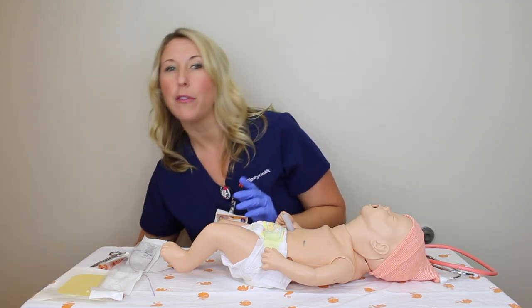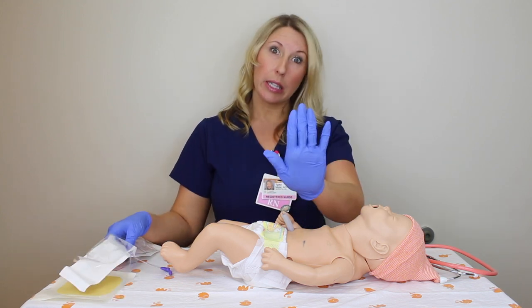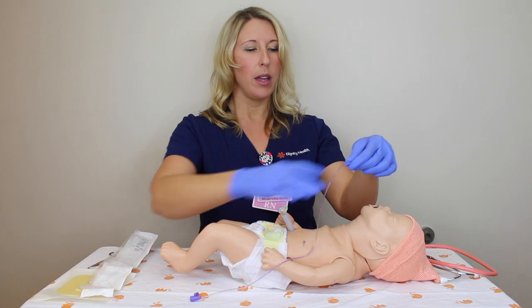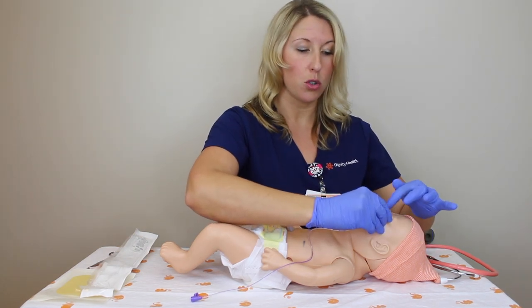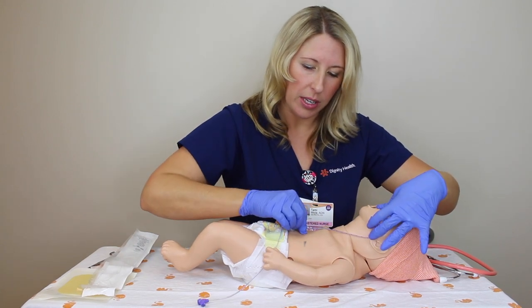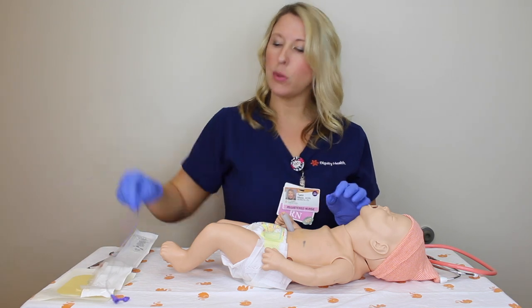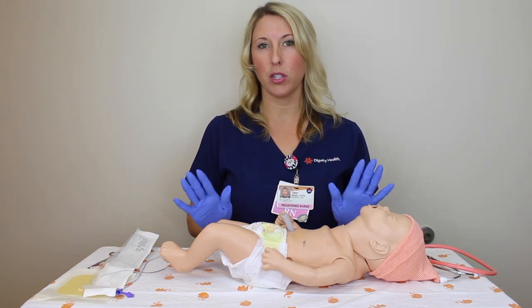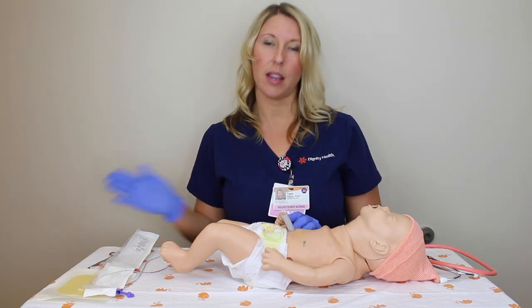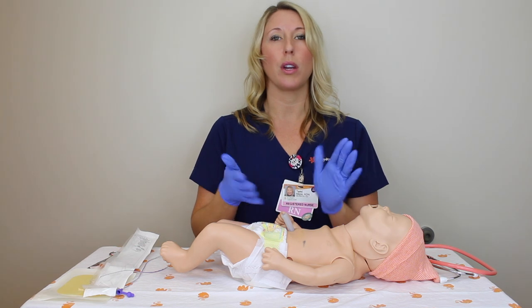If you do not know the weight of your patient, you can guesstimate to the best of your ability, or during a delivery situation you can take the tube itself, place it next to the nostril, go down to the earlobe, and curve it down underneath the xiphoid process. This baby is measuring to about 21. You would only use that method during an emergent delivery when you do not know the baby's exact weight. Otherwise refer to the policy: 3 times the weight in kilos, plus 12 for oral gastric, plus 13 for nasogastric.